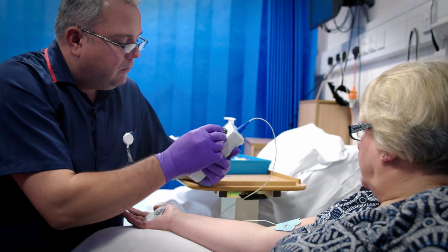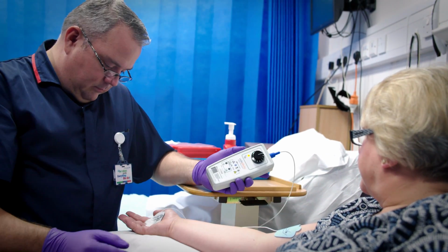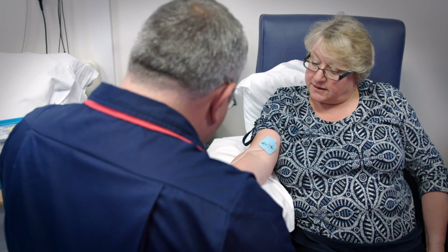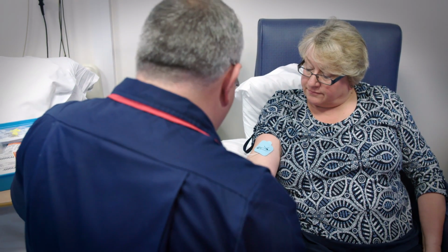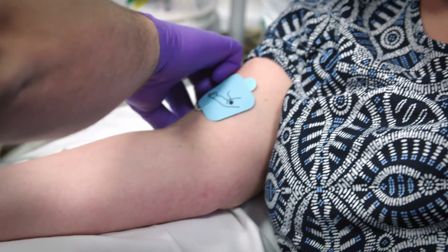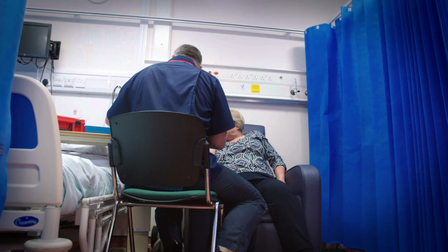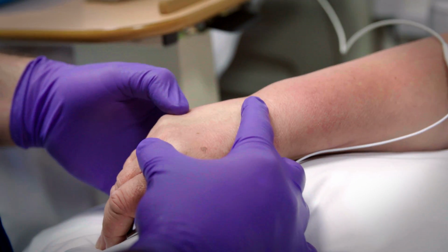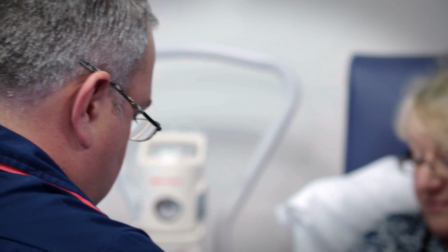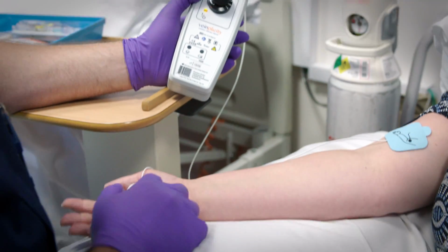For many patients who have a high body mass index, having blood taken is a stressful experience. It is not unusual for these patients to undergo numerous attempts which result in pain, discomfort, anxiety, hematomas, and poor quality blood results. Additional procedures like slapping, the use of hot packs and hydration are often used, and some patients even have to return another day, incurring additional transport costs and stress.